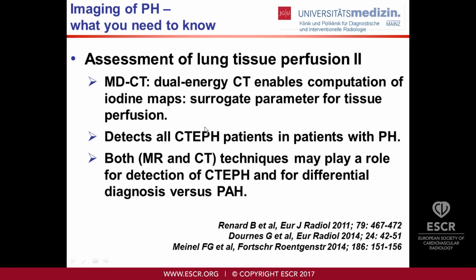And there are now some studies available where we could show that with this technique, all CTEPH patients may be diagnosed by spectral or dual energy CTs, and therefore this technique also may play a role in the diagnostic workup of these patients.